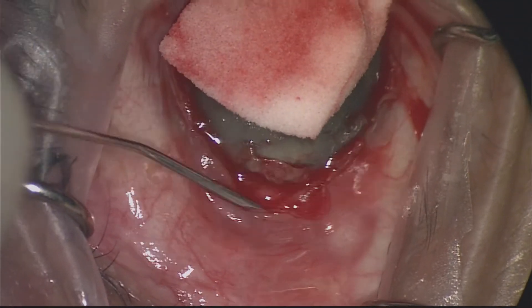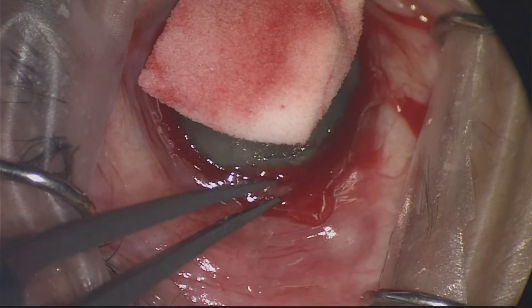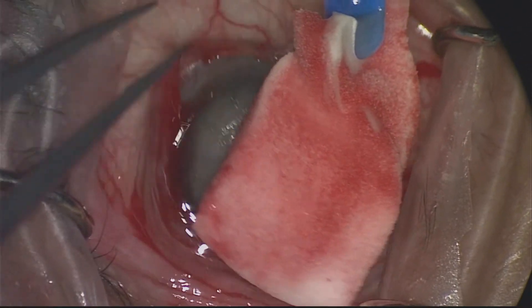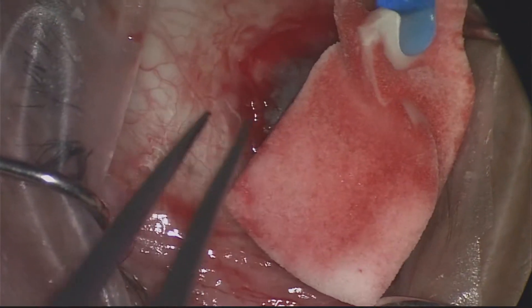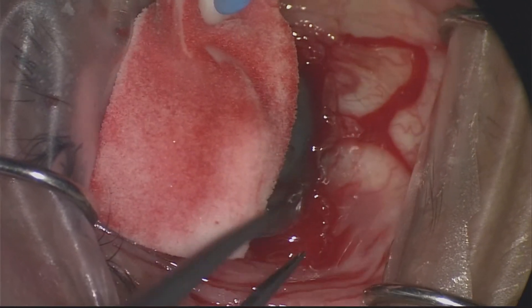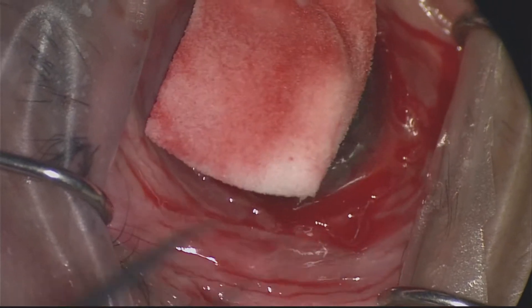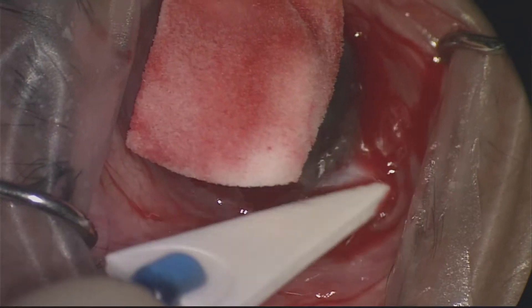Once you get the plane on the cornea, you need to think about doing a peritomy. Rather than doing a separate peritomy, I just push the conjunctival tissue — as this is all one plane — beyond the limbus, away from the limbus. You can see me here with a pair of tying forceps pulling the tissue away quite nicely. This is all scar tissue, and the fundamental aspect of limbal stem cell deficiency is corneal conjunctivalization — you basically want to take this tissue as far away from the limbal area as possible.